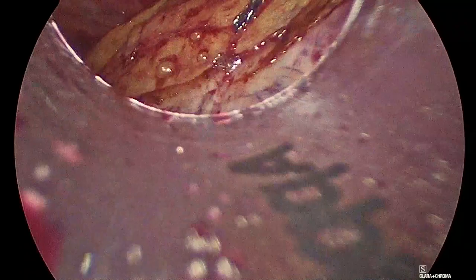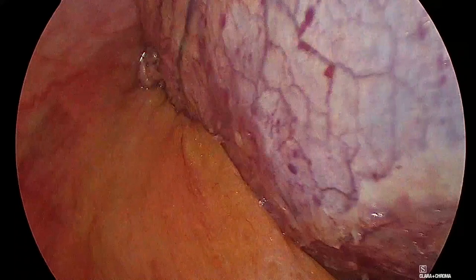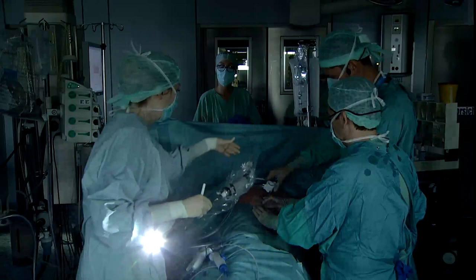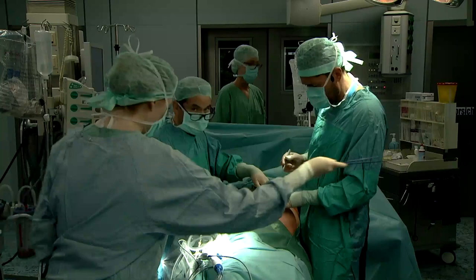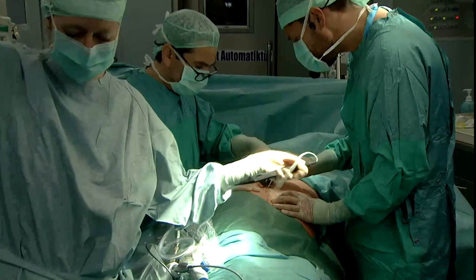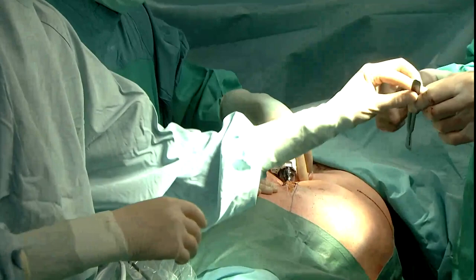And we mark the incision side. The incision side will be right from my trocar down to the pubic bone. And it will be like a 7 centimeter, 8 centimeter incision. Okay, hold it like that. So you see, now the pubic bone is here, okay? And I really want to go pararectal. There you go. That's going to be my incision, which I would do in any case to take the specimen out.